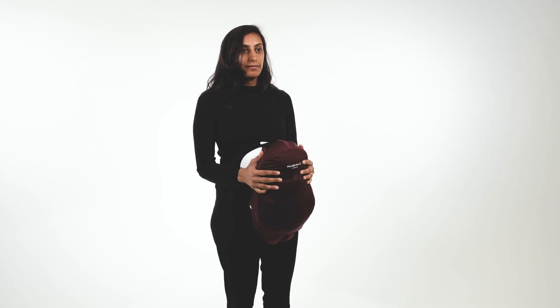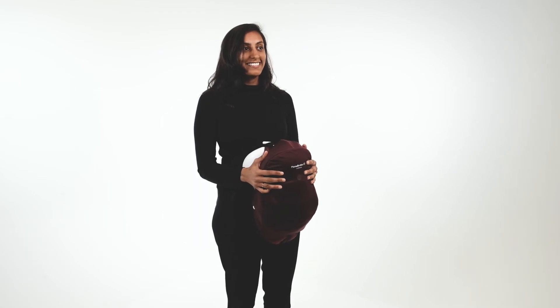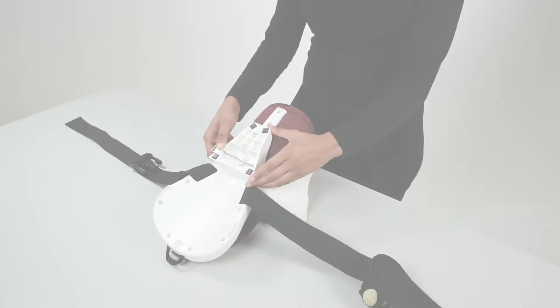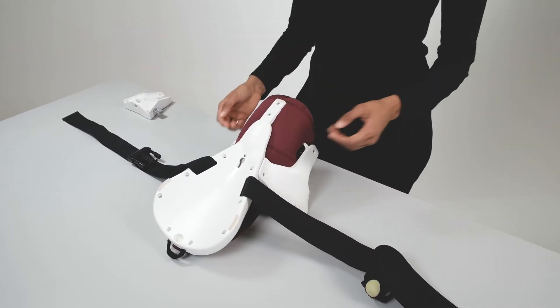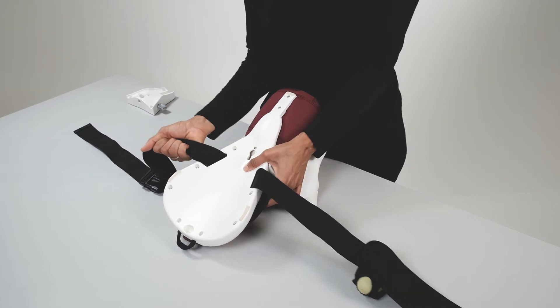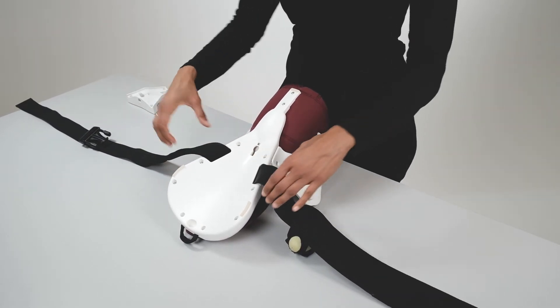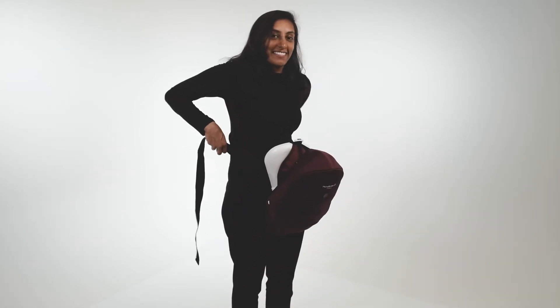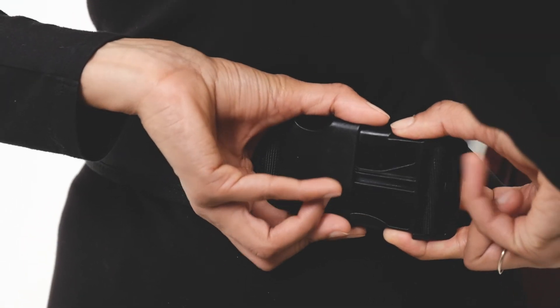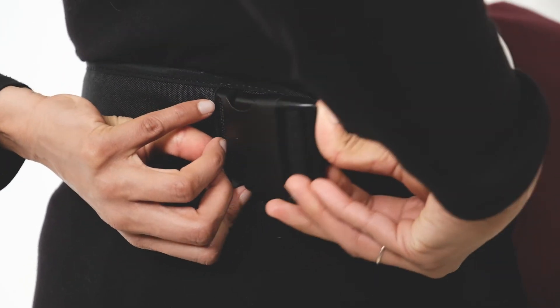Mama Berthy CS is most effective when worn during simulation. Before putting Mama Berthy CS on, remove the table attachment from the back of the pelvis. Adjust the length of the belt. Hold Mama Berthy on your front and wrap the belt around your back. Connect the clasp and tighten the belt.